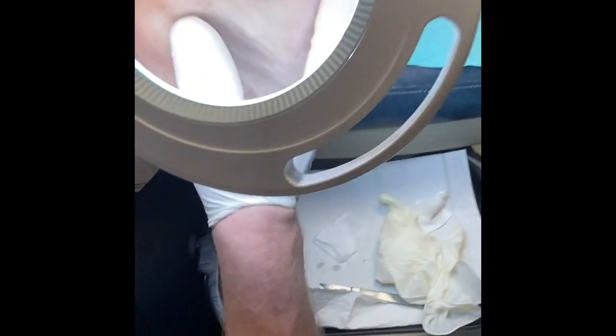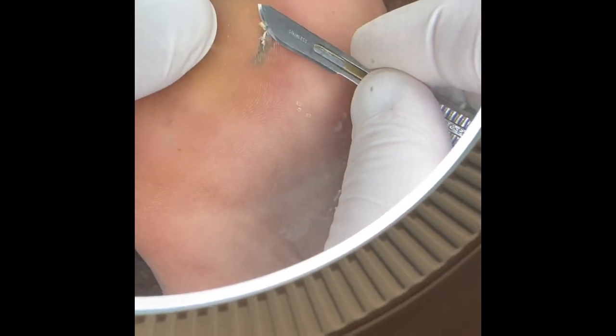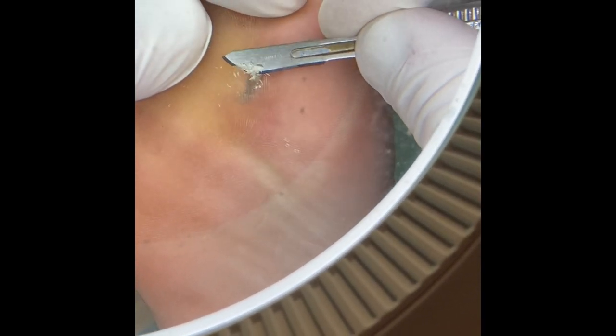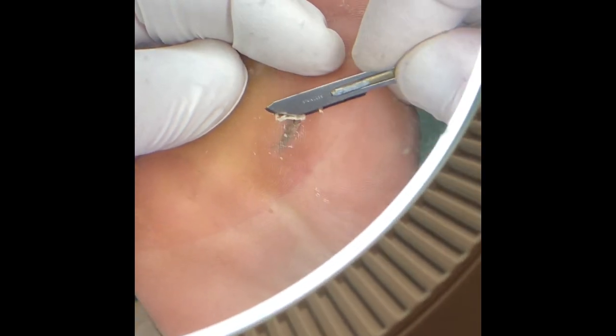One thing that we do pretty well is take out splinters. What we should do is pare off the top — the roof of this thing — with no discomfort. This patient did not have any pain when I was doing this. In reality, I should be doing it in the opposite direction, from south to north, in the direction we want the splinter to go. We don't want to accidentally push the splinter deeper. So here I switch to the 15 blade.